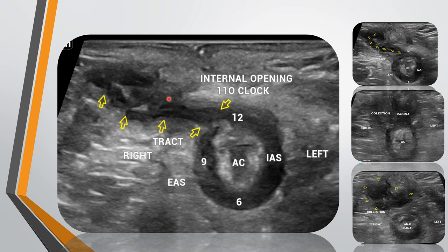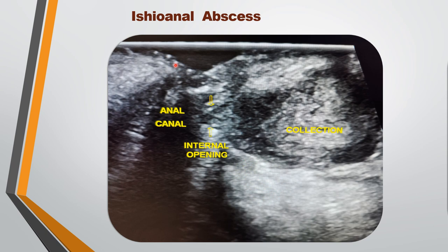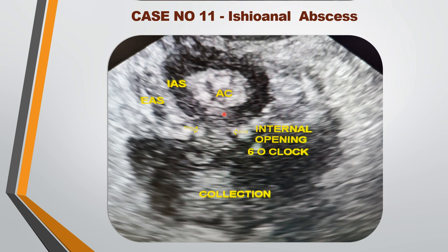In the next case, the linear probe was kept on the anal opening, revealing the anal canal and a large collection with debris material in the posterior ischioanal space, communicating with the anal canal. The distance of the internal opening from the anal opening must be recorded. On axial sections, the internal sphincter, anal mucosa, and external anal sphincter are identified. The collection is located in the posterior ischioanal fossa and communicates with the anal canal at about 6 o'clock position.